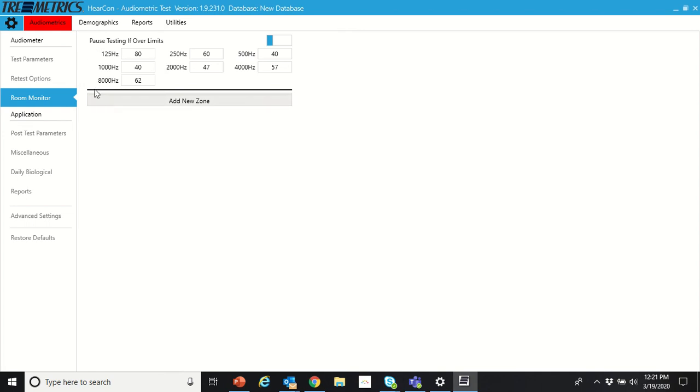These values are going to default to OSHA. When it comes from the factory, these are going to be the OSHA values. If you test somewhere that wants to use ANSI or uses a different set of values, just type in the numbers you want in these fields and you can override that.